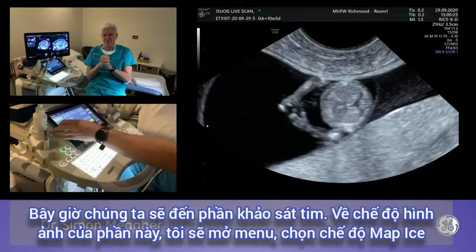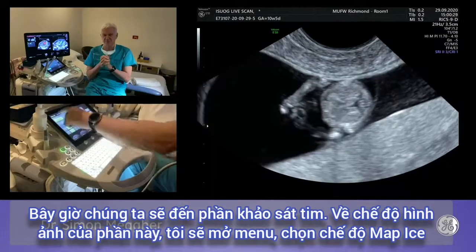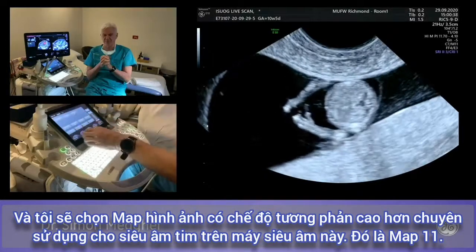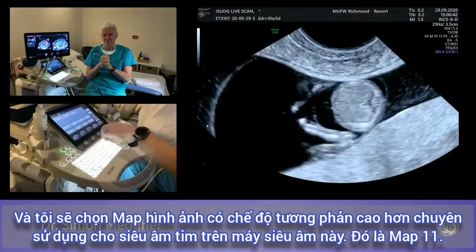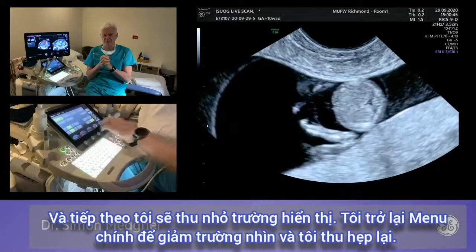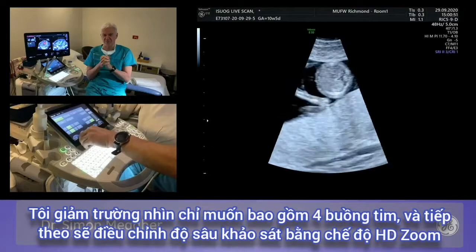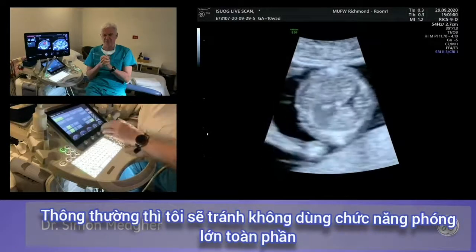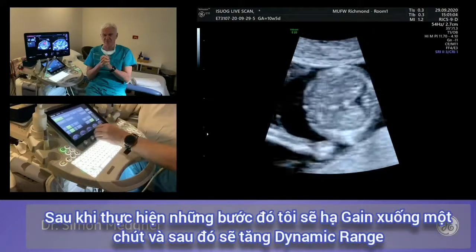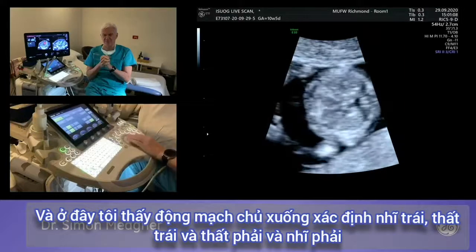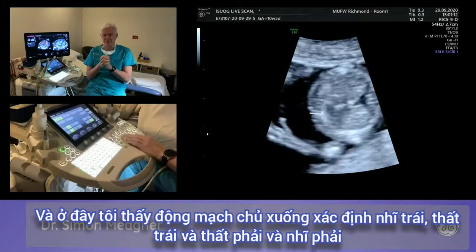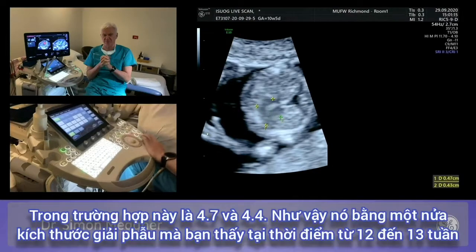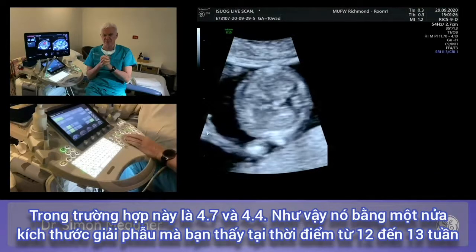For the fetal heart examination: enter the menu, select map ice, then a more contrasty map — listed as map 11 on this system — used for cardiac imaging. Reduce sector width to just catch the four-chamber view. Use HD zoom rather than total zoom. Pull back gain slightly and increase dynamic range. Now visible is the descending aorta defining the left atrium, left ventricle, right ventricle, and right atrium. The heart generally measures around 4 to 5 millimeters at this stage — this measures 4.7 and 4.4 — approximately half the size seen at an anatomy scan at 12 to 13 weeks.